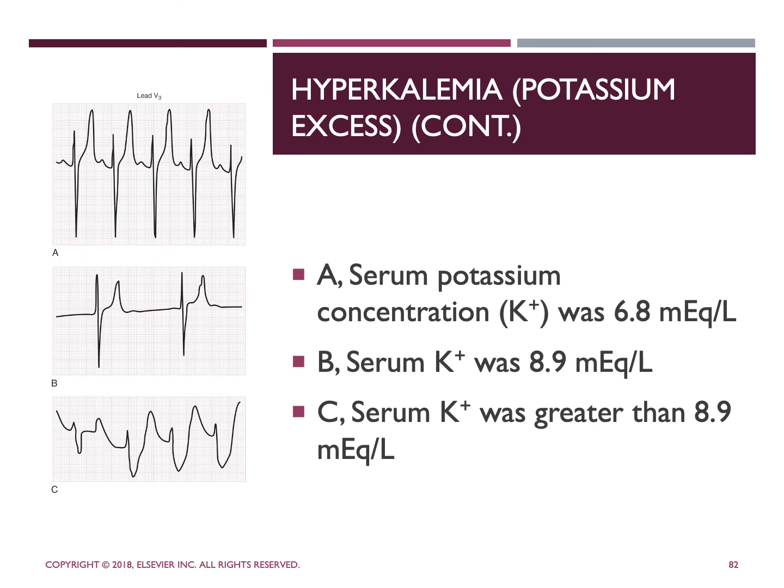What you're looking at in A, which is going to be the top one, the serum potassium concentration, potassium is also known as K plus, was 6.8. And what you should really be looking at is the peaked T waves together with sinus rhythm.